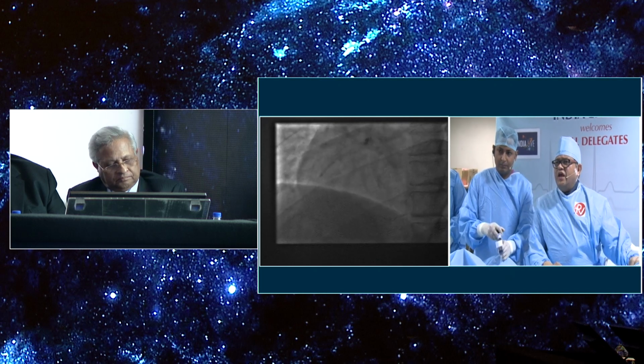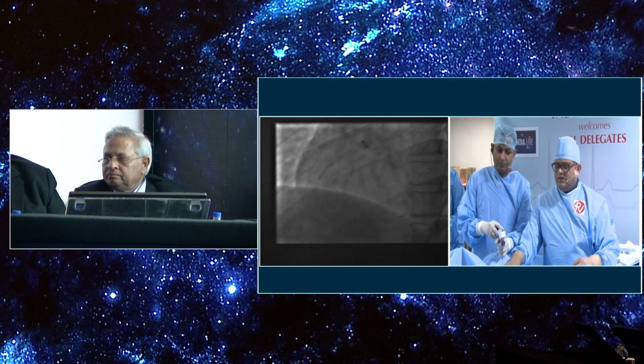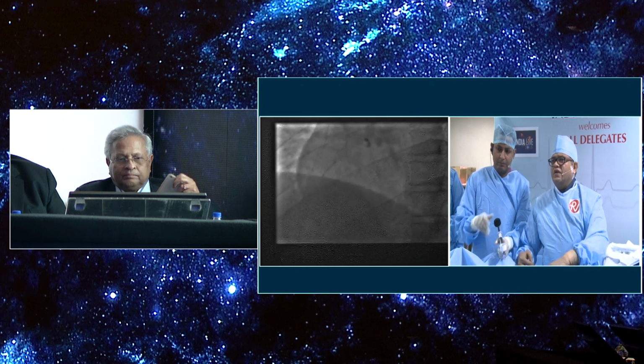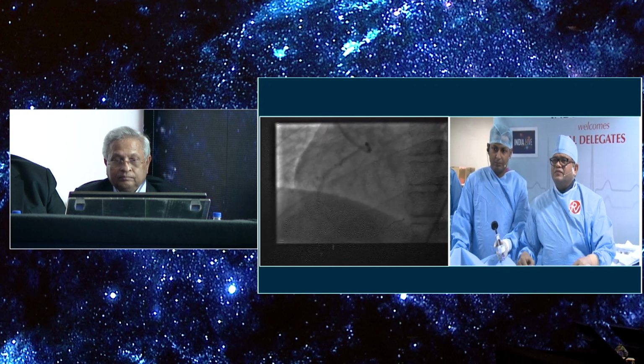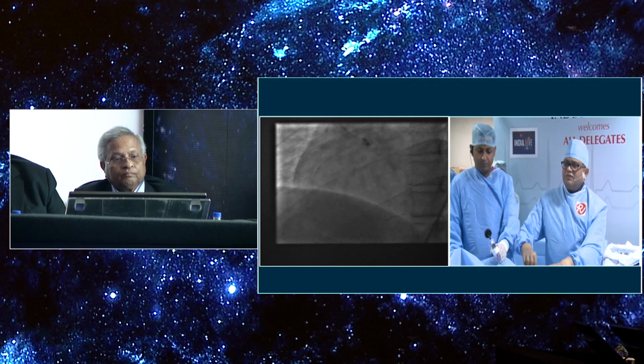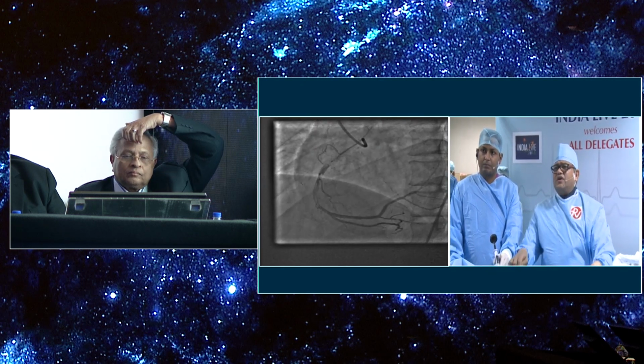Here I have anchored the balloon. Let me push slightly. Dr. Mishra: The risk of dissecting the guiding ostium of the coronary would be more with an AL1 in this situation. And that is why I would really prefer what Dr. Punamaya has suggested: keep your guide close, use a guideliner, which is a much softer catheter and much more forgiving. So therefore you may relatively escape better.